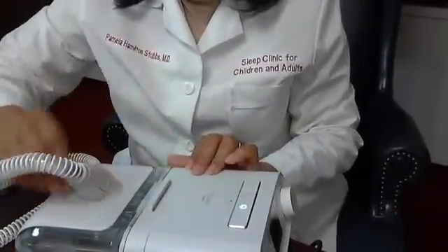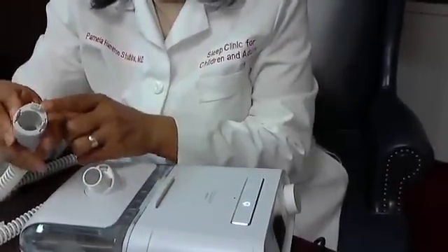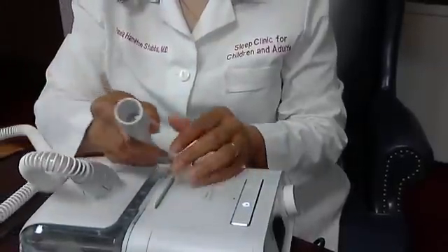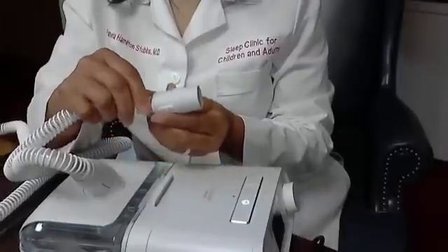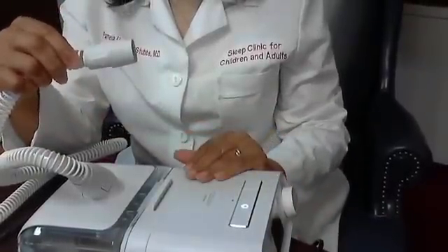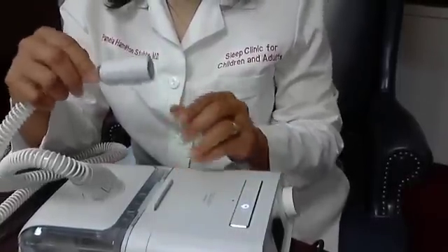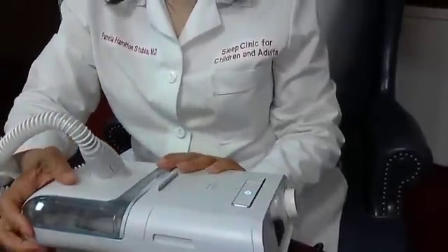This is the standard tubing that hooks to the humidifier — it has three little holes that you align and press in. The other end is standard tubing that fits a mask from almost any company that makes a positive airway pressure mask. So you may find that a mask from a company other than Philips Respironics is more comfortable — don't be concerned, just make sure it fits. You can use a different mask with this machine.